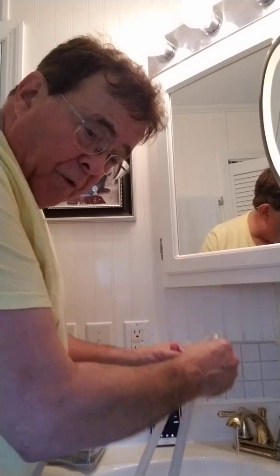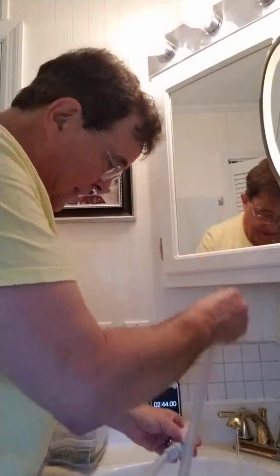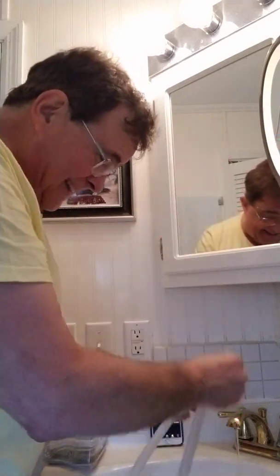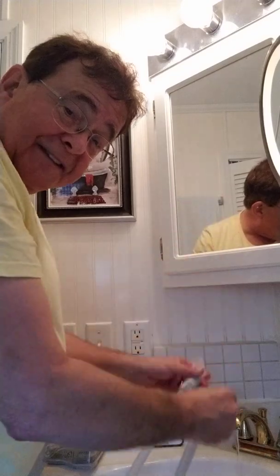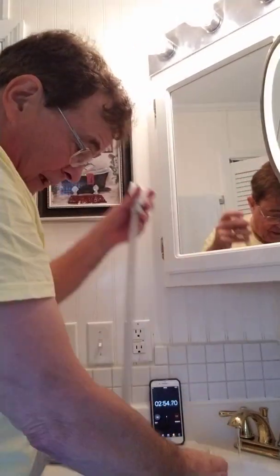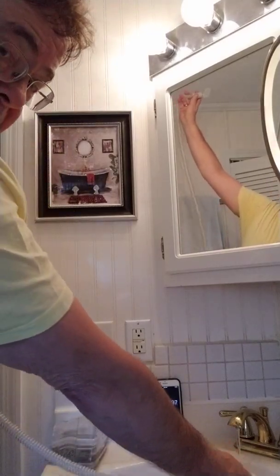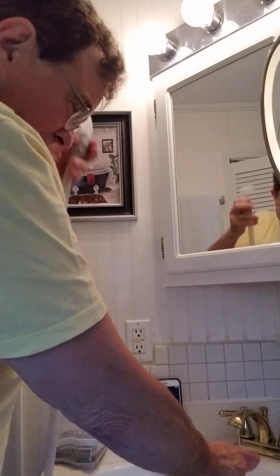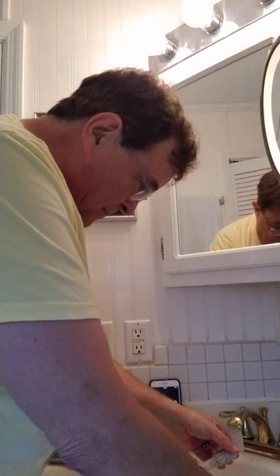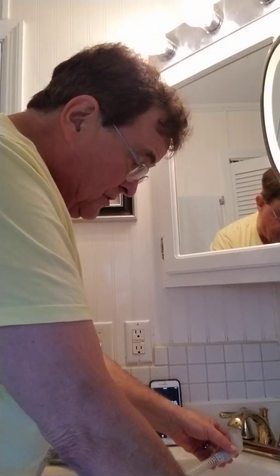And then it's back and forth, back and forth. Hey, how about that? Isn't that easy cleaning? See, I'm cleaning all those crevices in this hose because it's all corrugated. Now, I just hold up the one end and let it drain into the sink. Oh, boy, I can even see the other end. Now, I'll run the water a little bit faster there. And now we run water through this twice to get all the residual soap and stuff out.